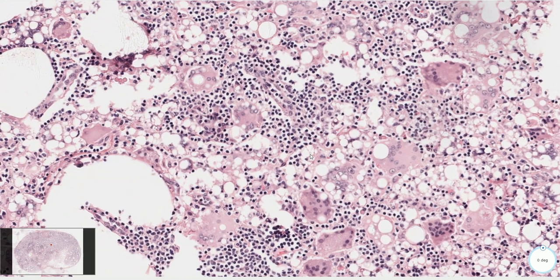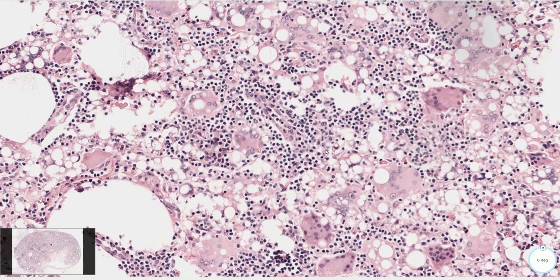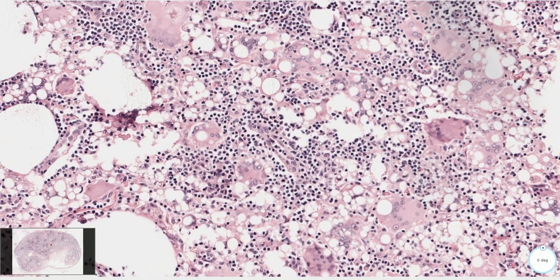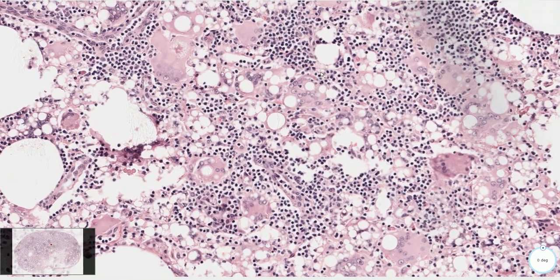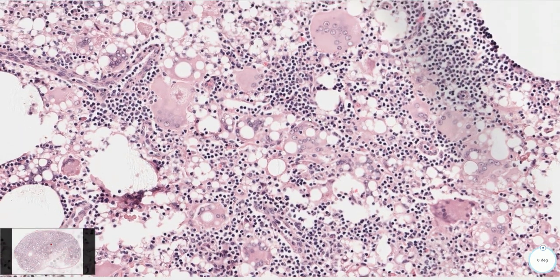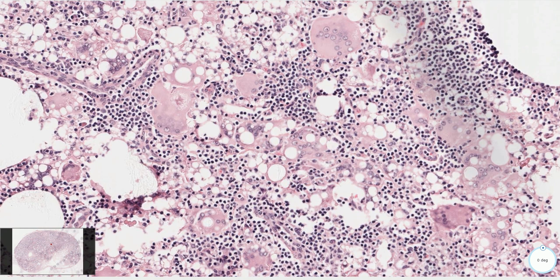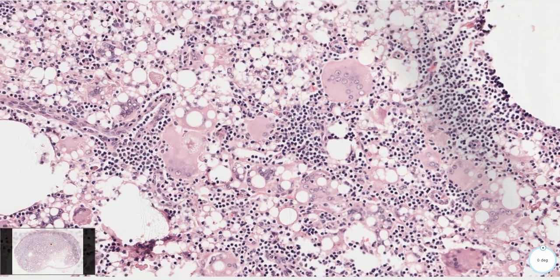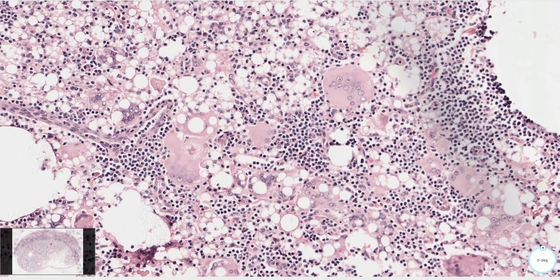Breast silicone implants may be associated with leakage of silicone material through the shell of the implant. Some of these silicone implants may also rupture. However, we can see examples of silicone lymphadenopathy even without a rupture, because some amount of silicone can get through the capsule even without one.